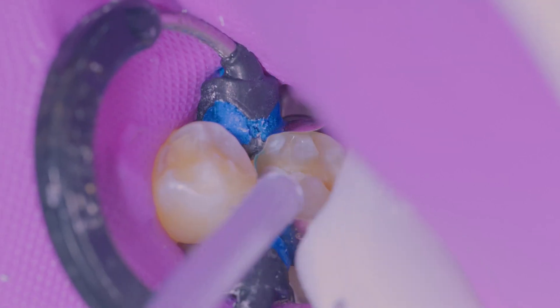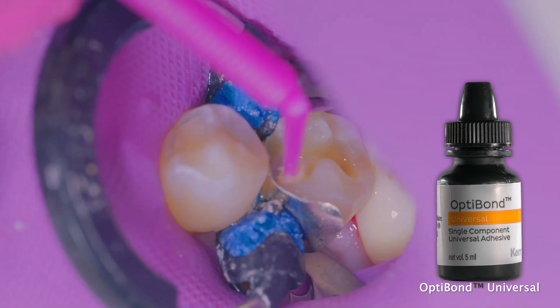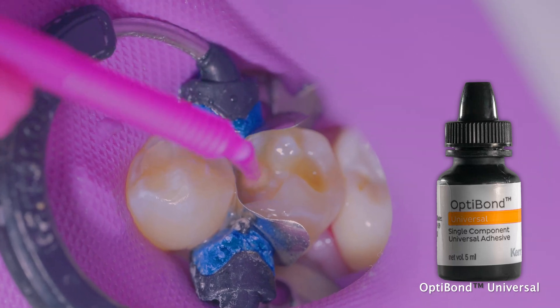You're going to go ahead and rinse it for 15 seconds and then air dry it, but you really want to make sure that you're not desiccating the preparation. Next I'm applying the OptiBond universal adhesive. You can use this adhesive on a self-etching, selective etching, or total etching technique.